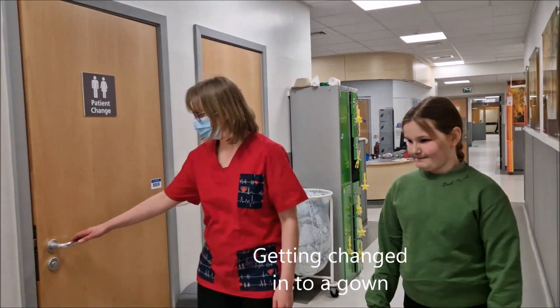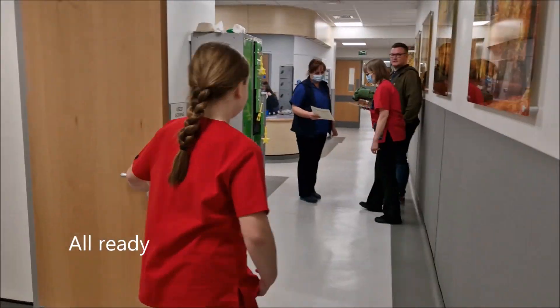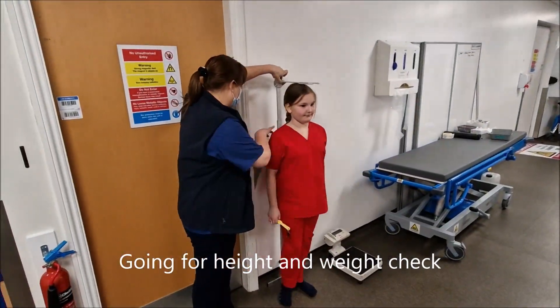Then we'll ask you to get changed because the MRI scanner is one ginormous magnet, or you can wear your own metal-free clothes. Next we're going to measure your height and weight so the scanner knows what size of person is in the MRI scanner.